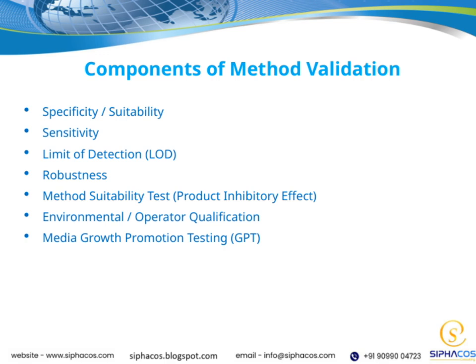Then we have the limit of detection, or LOD, which defines that minimum detectable level. Knowing this helps us understand the method's limits. Robustness is also important. It assesses how consistent our results are under slight variations in conditions, ensuring reliability.